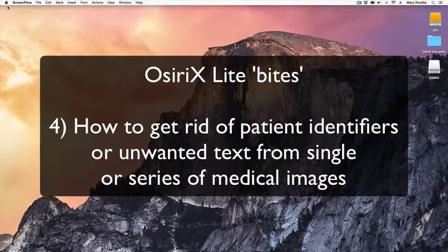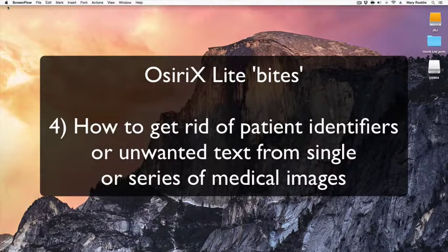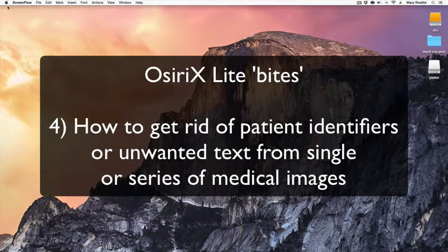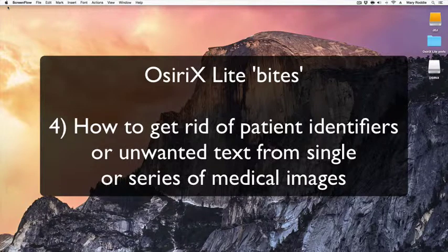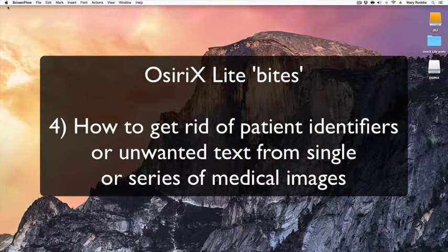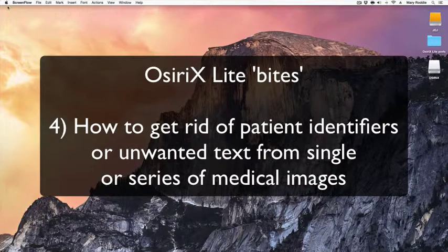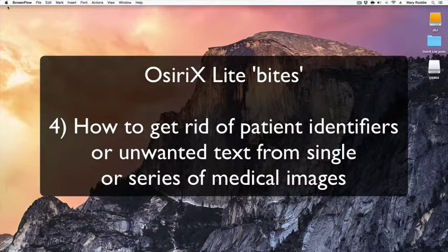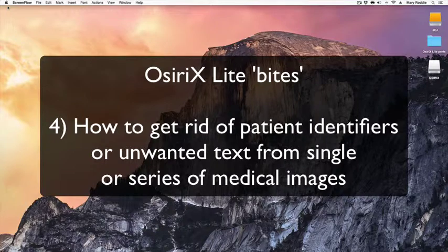Hello, my name is Mary Roddy from Charing Cross Hospital in London and the UK OsiriX User Group. Today's tutorial is aimed at delegates who attended the recent Imperial OsiriX Masterclass at the Royal College of Radiologists.